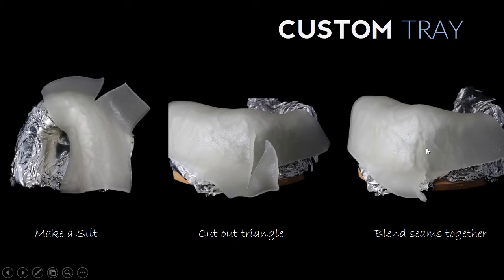You're going to end up seeing a seam, but you can easily blend that seam together with just a light amount of finger pressure. This material before you cure it is pretty pliable and adapts pretty well, especially when you put just a little bit of finger pressure and you kind of rub the two pieces together. That soft Triad will tend to blend together.